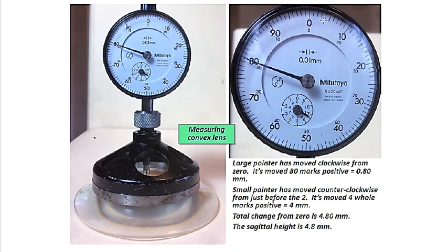Since your larger dial moves in this direction from the 0, that is clockwise. Therefore the little dial is going to go counterclockwise from 2, so there's a 1 and then 2 and then 3, 4 whole millimeters that have been moved. So that's your 4, and then from 4 to this much is about 80, so you have about 4.80 millimeters. That is your sagittal height for this convex lens.